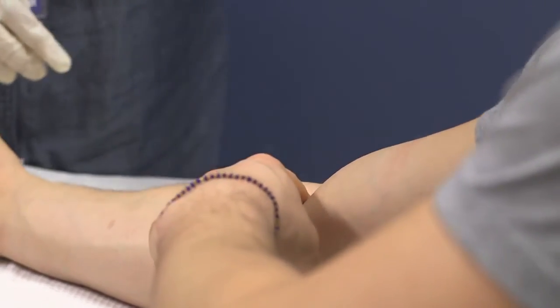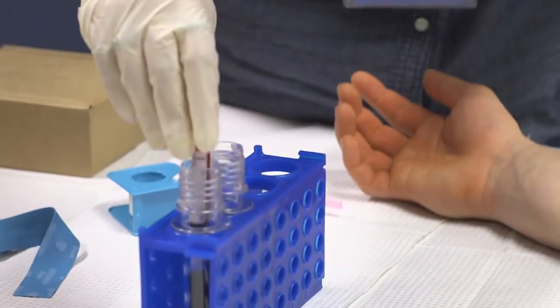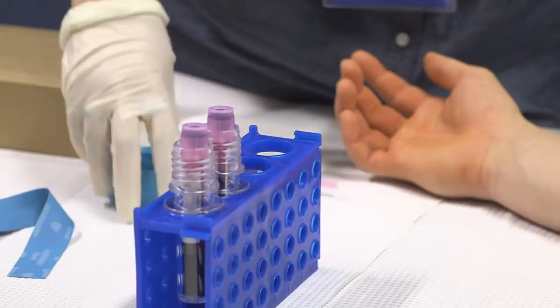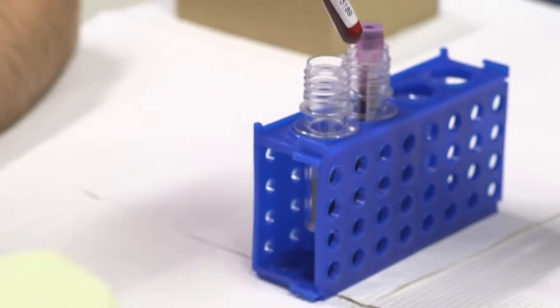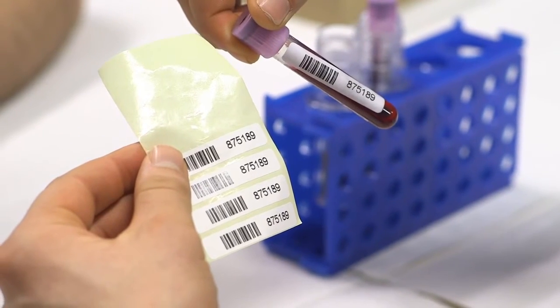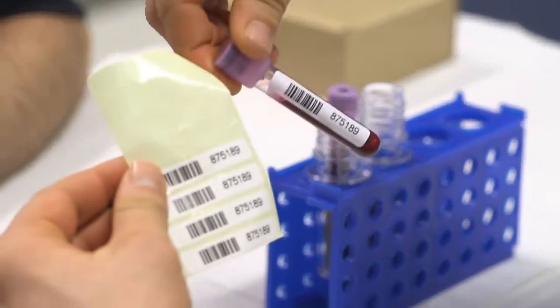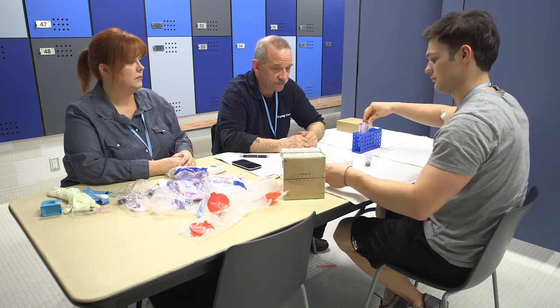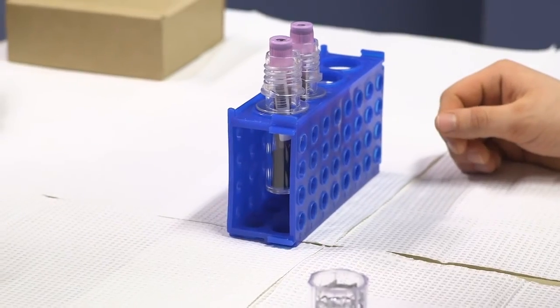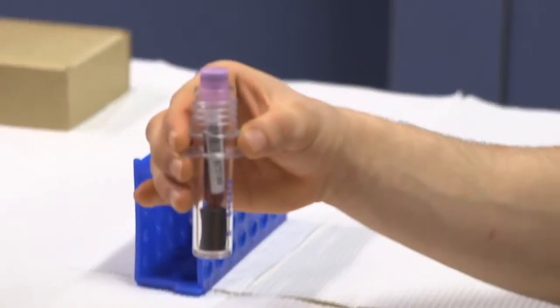The BCO will invert the tubes eight to ten times, then place the tubes upright into the kits and provide any athlete-specific aftercare procedures. You will then seal the blood samples, document the related information, and prepare the sample for transport. You will be asked to place the bottles back into the holder and destroy the extra barcode stickers and place them in the garbage. For certain tubes, it is important that the samples remain at room temperature for fifteen minutes before they are placed into the cooler.